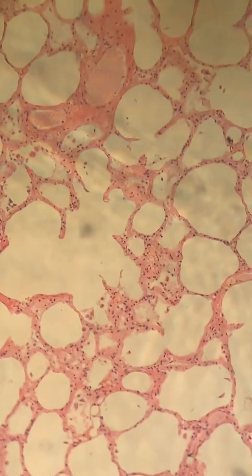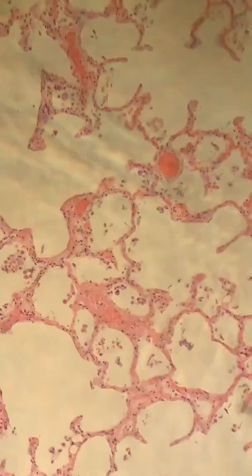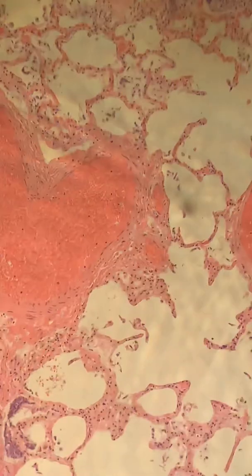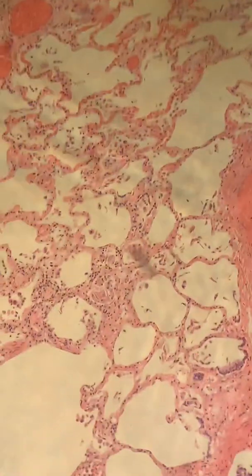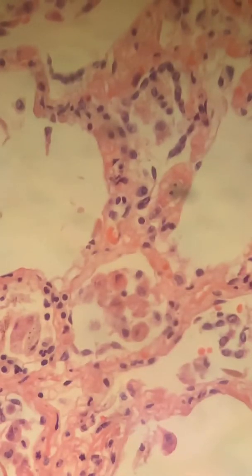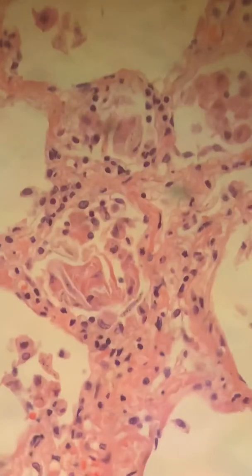But you can see the polys in some of the alveolar spaces and in the interstitium, but it's not as obvious on this slide, so I may have to go to another slide. But you can see some colonized bacteria there and the yeast. So more than likely the yeast perhaps came from the oral cavity, perhaps through aspiration pneumonia. And you can see some foamy histiocytes as well in some of the alveolar spaces.